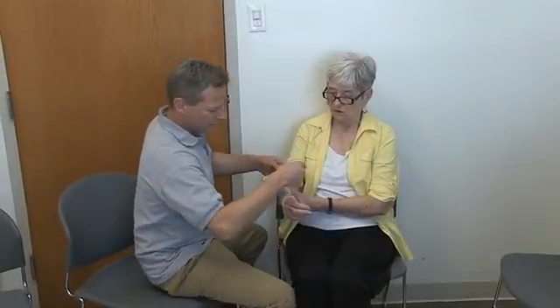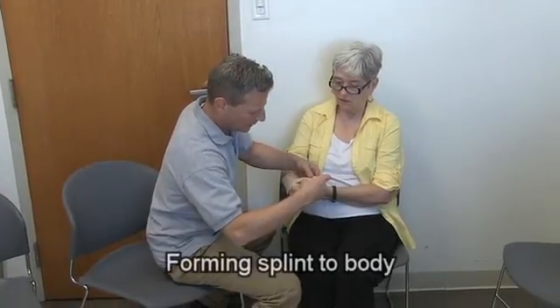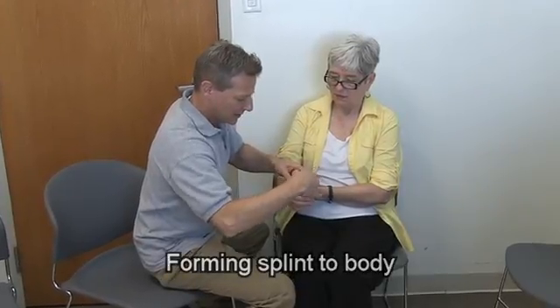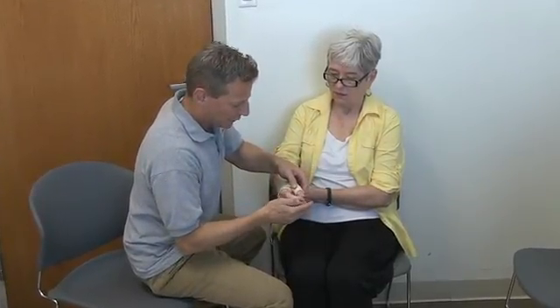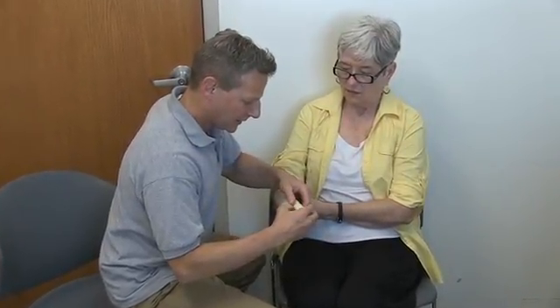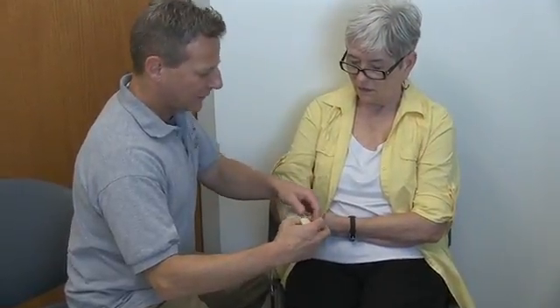Now we're going to form the splint on Linda. It's a little bit warm so we try to be careful. Let's hold your next finger right there for me. How's that feel?